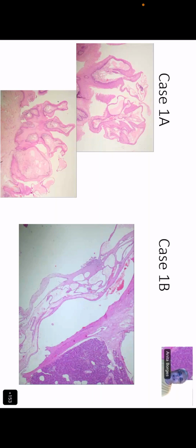What does it mean? That proliferation that is growing exophytically, or for that matter, endophytically into a space or into its stroma, actually is of epithelial origin. Now you look very carefully over here. Do you think that this lesion is exophytic, and it definitely is exophytic, do you agree, Diya? Yes, ma'am.